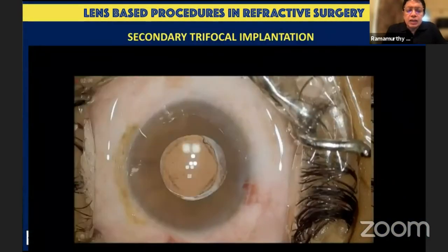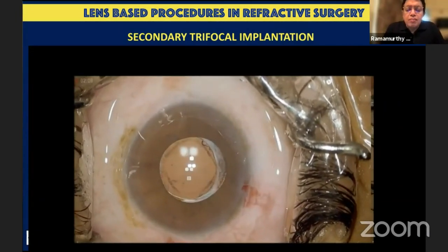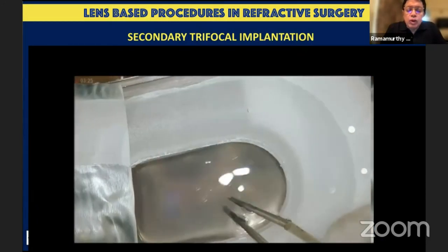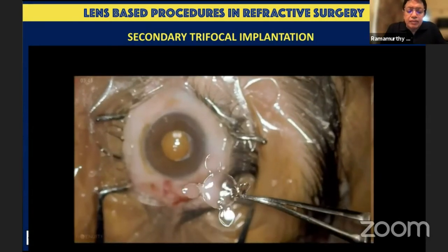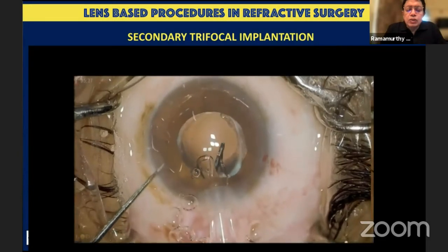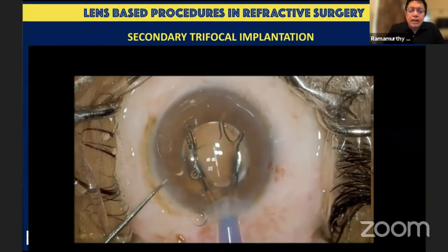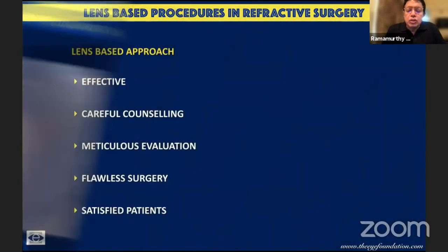Nowadays we are also coming across patients who have a monofocal implant in the first eye and want a bifocal or a trifocal in the other eye, and we go ahead and implant that. In case the patient wants a secondary implantation of a trifocal lens, that is again possible in these situations. As you can see, this is an Indian piggyback lens that is available at a reasonable cost, and you can not only deal with any residual refractive error, but also introduce multifocality.